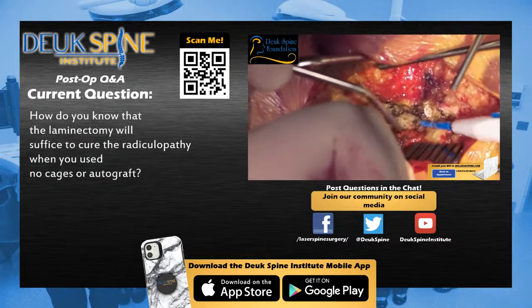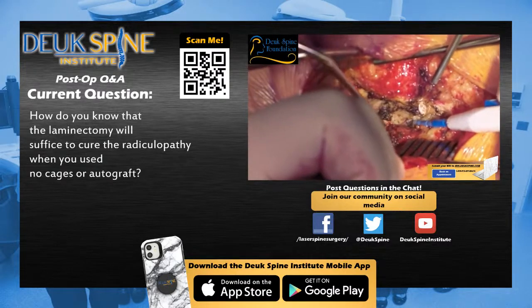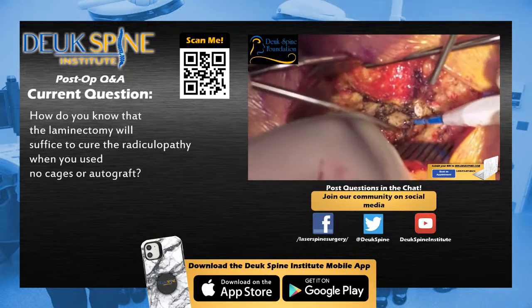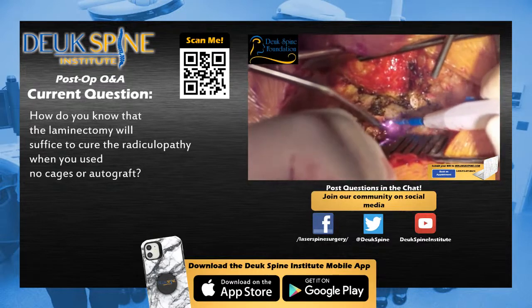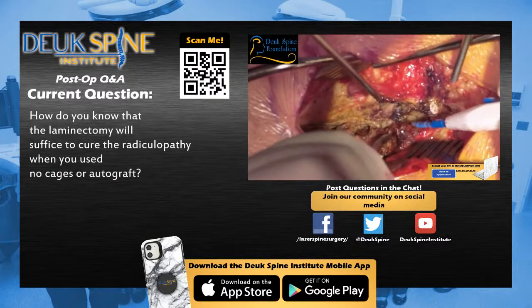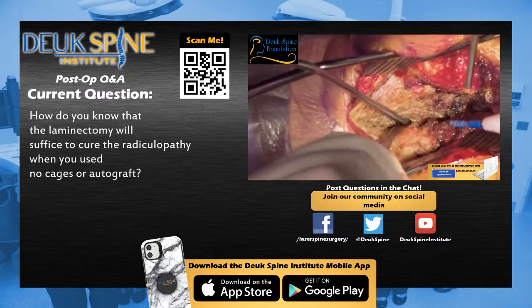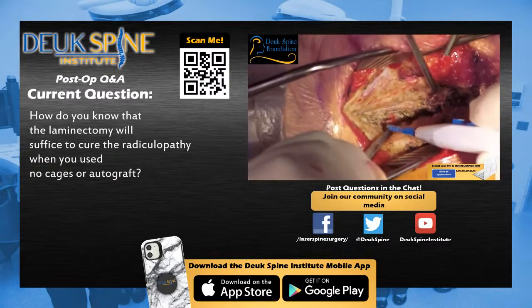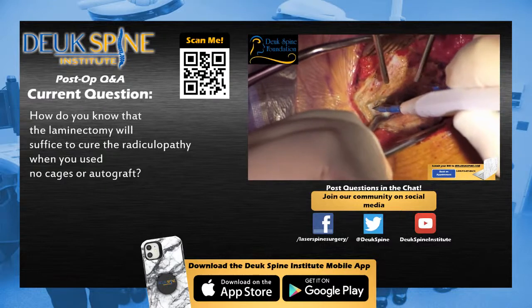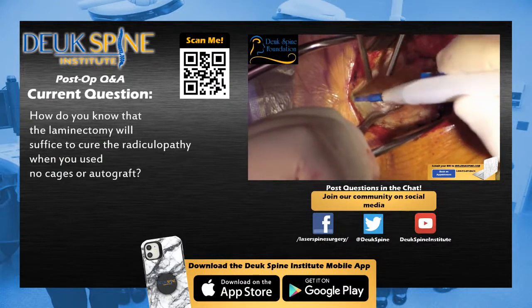So remember, we talked about the different stages of surgery. You have decompression, which is the laminectomy and foramenotomy, getting the pressure off the spinal cord and nerves. We have the realignment, which is putting the spine back into its natural alignment, which we did with the rod, the way we contoured the rod to create lordosis after the patient's taken out of the pins. And then the stabilization is with the screws, rods, plus the fusion. So we use the autograft and allograft to stabilize with fusion.